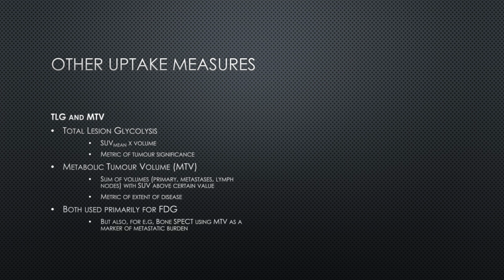I said these have really been designed for FDG, but they're also useful with other radiopharmaceuticals as well. So, for example, in bone SPECT, MTV or a version of it has been used as a marker of bone metastatic burden.